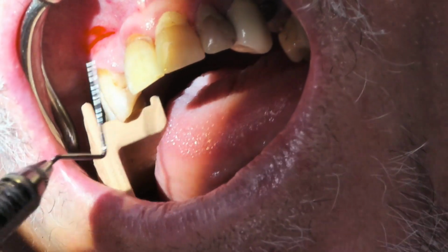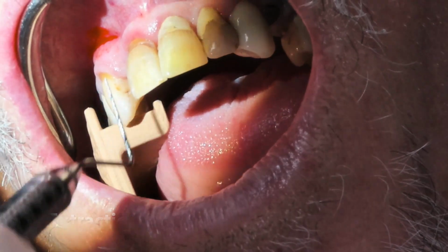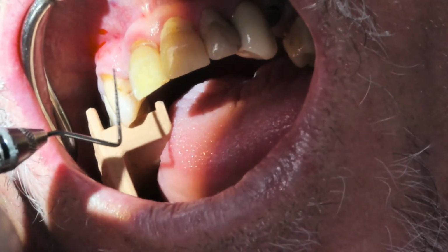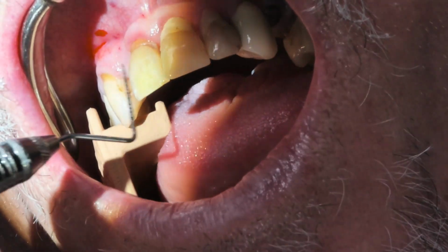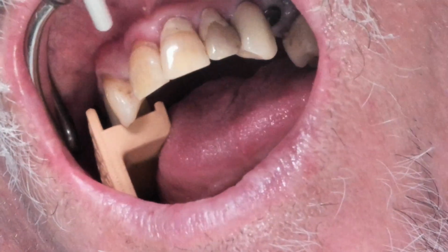So our plan for today, probe, please, is on Alan. We're going to be treating number 7, 9, and 11. We're going to do pontics at 8 and 10, so we'll be doing ovate pontics. We're going to be doing Z-Systems one-piece tapered implants, 4.0 diameters by 12, once again at 7, 9, and 11.